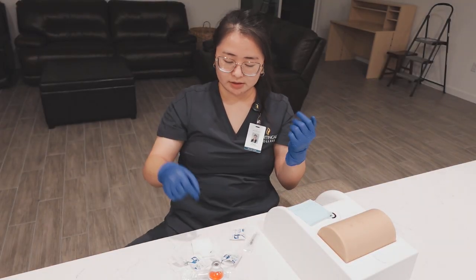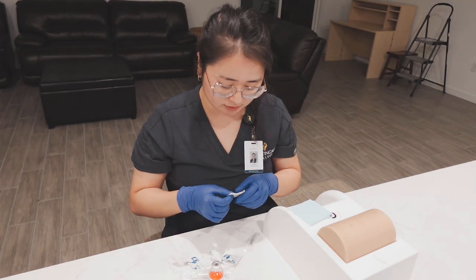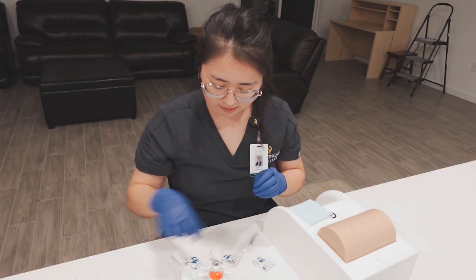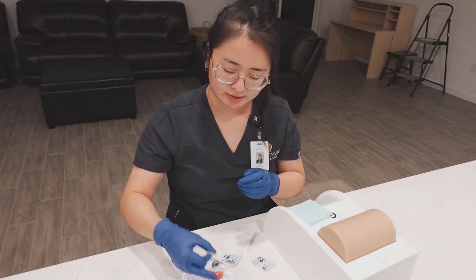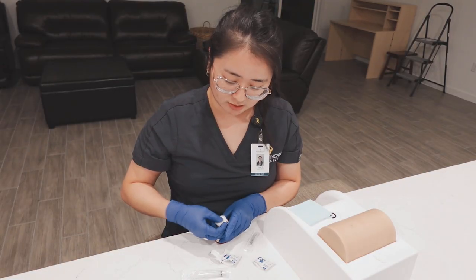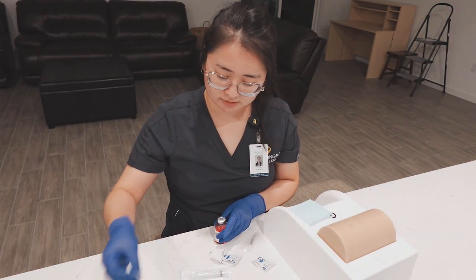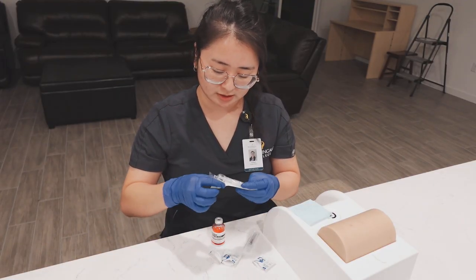All right, so let me just move this real quick. Okay, the first thing we're going to use is alcohol prep pad. These are open due to practice reasons, but in actuality, we would not use already open supplies. Okay, we're going to dispose of that. I'm going to take my syringe. We're going to open that.